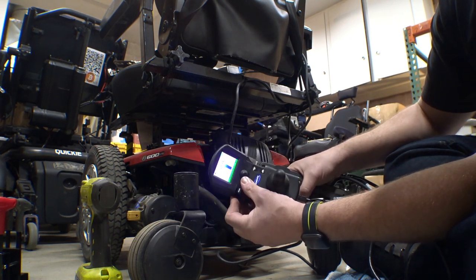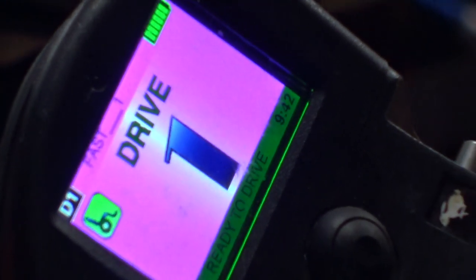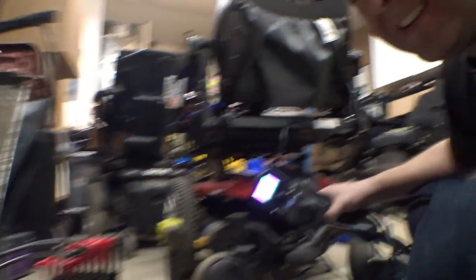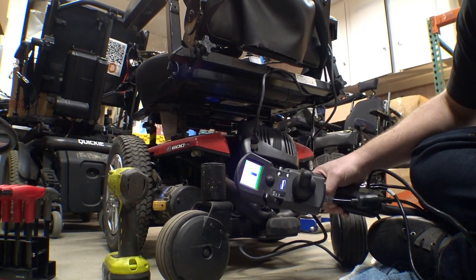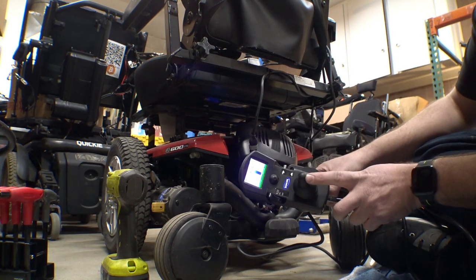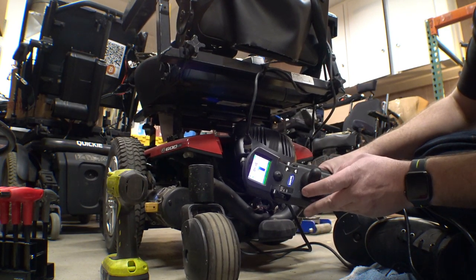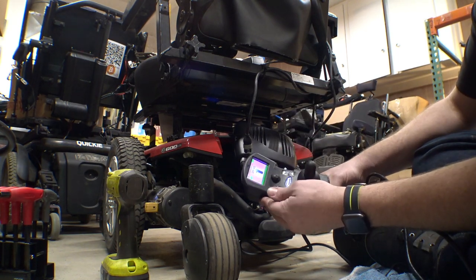The background is hot pink on this — can you see that? Why did I not have this controller set up on the pink chair? That would have been awesome. I actually didn't even know this was a color screen. Let's see if the brakes click off. Hey, it seems to. Cool, that's good news. Ridiculously easy swap then — Drive 2, Slow 3, Tilt System.